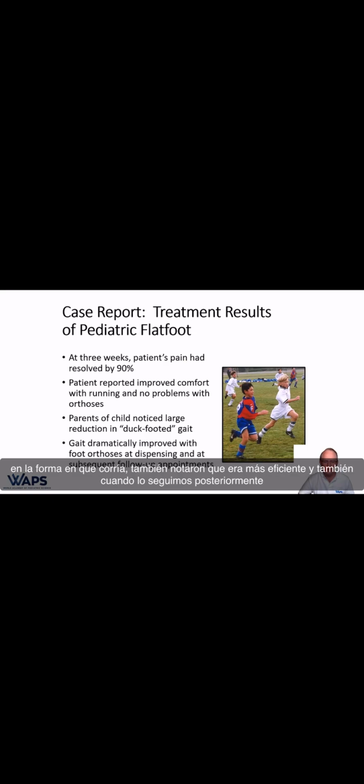There is increased comfort with running. No problems with the orthosis, such as arch irritation. Parents were quite pleased since they noticed that the child's gait had changed from a duck-footed gait to more like their other kids in the way he ran. They also noticed he was more efficient. And when we subsequently followed him up in the clinic, he was showing continued lack of pain, having more fun, playing more, and not running as inefficiently and with such a duck-footed gait as he had before he got the orthotics.